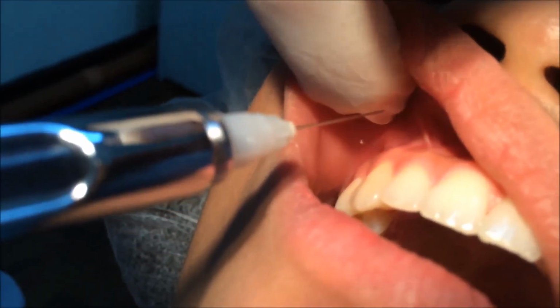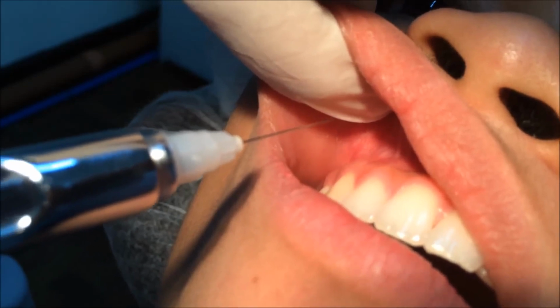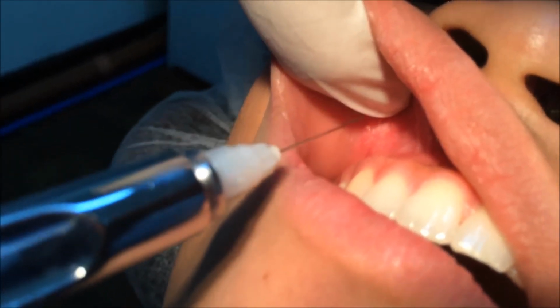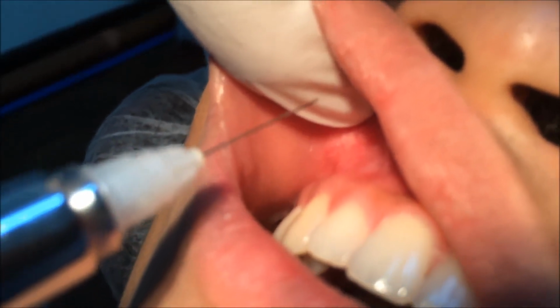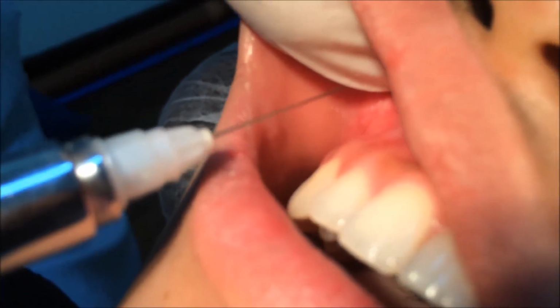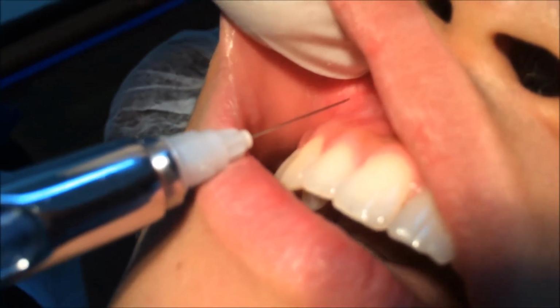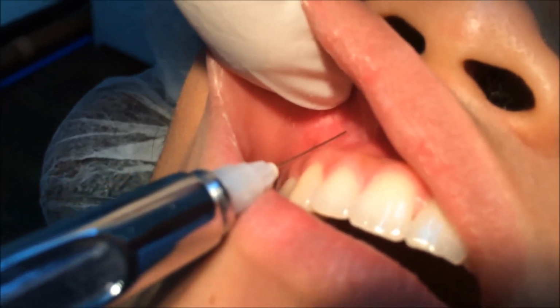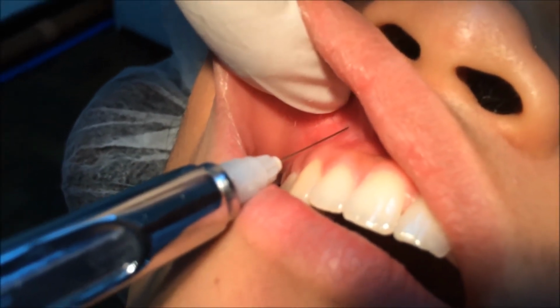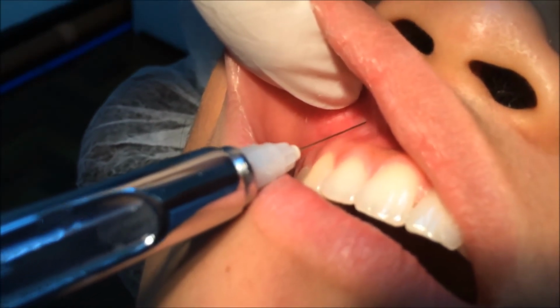We lift the lip, pulling the tissue taut. Hold the syringe parallel to the long axis of the tooth. We insert this 27-gauge short needle into the height of the mucobuccal fold over the target tooth. We advance the needle until the bevel is at or above the apical region of the tooth.